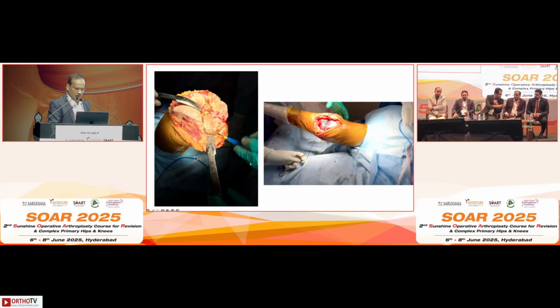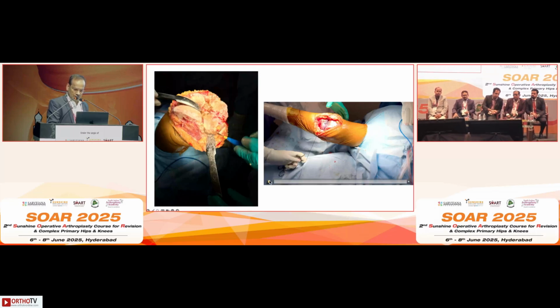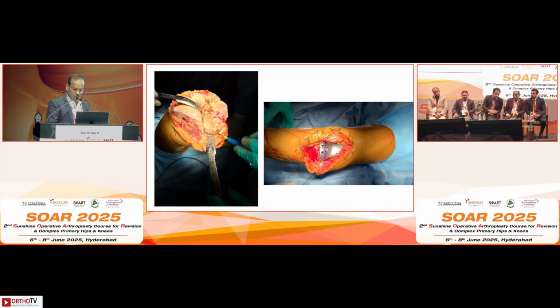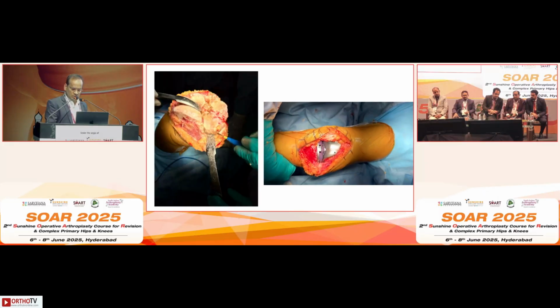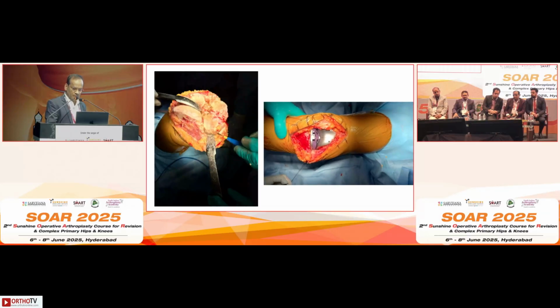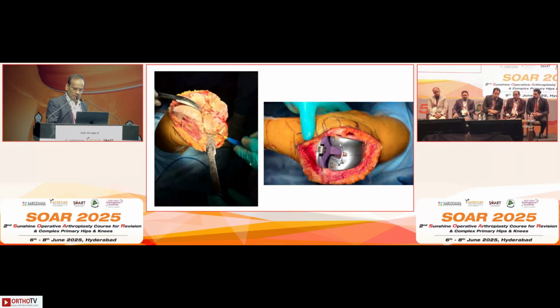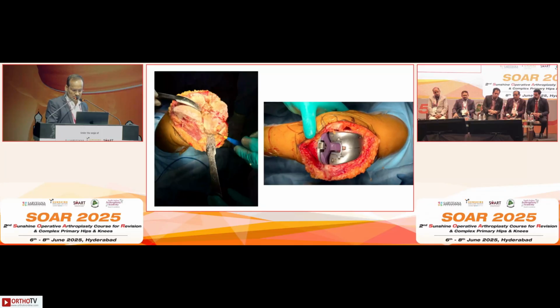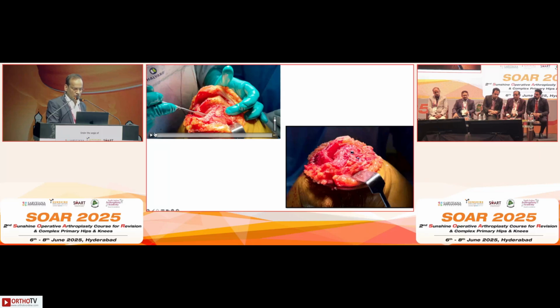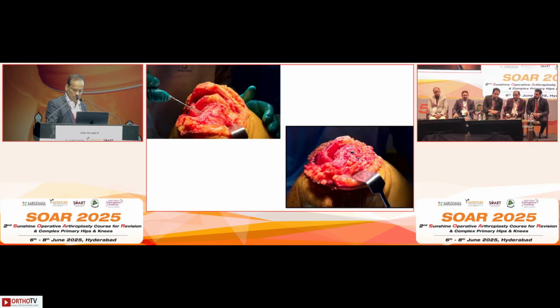Yeah. This is a medial parapatellar approach. We have done a significant release of the ITB from the Gerdy's tubercle. And after the trial implant, you can see in full extension, if you give a valgus force while the lateral side is stabilized, you can see the opening. But once you flex the knee to 90 degrees, you can see that even with full force, it gets stabilized. So this is why I can do an MCL advancement. I do a medial epicondylar osteotomy and just pull it proximally, because the flexion is okay, the extension is lax, and you fix it.